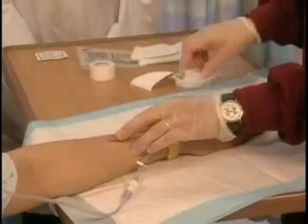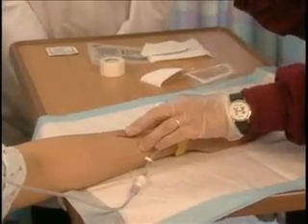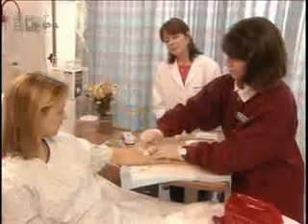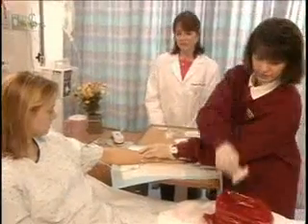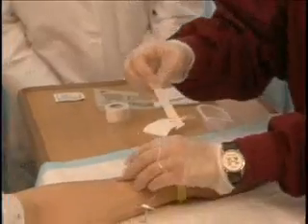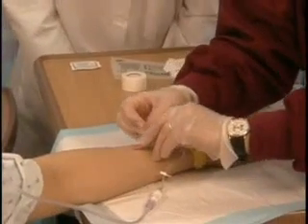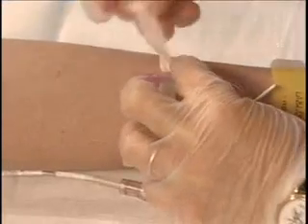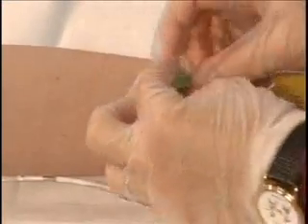Now cleanse the entry site using friction for 30 seconds, and let that dry. Now you can apply a new sterile tape strip to the IV catheter at the entry site. Then the transparent dressing.